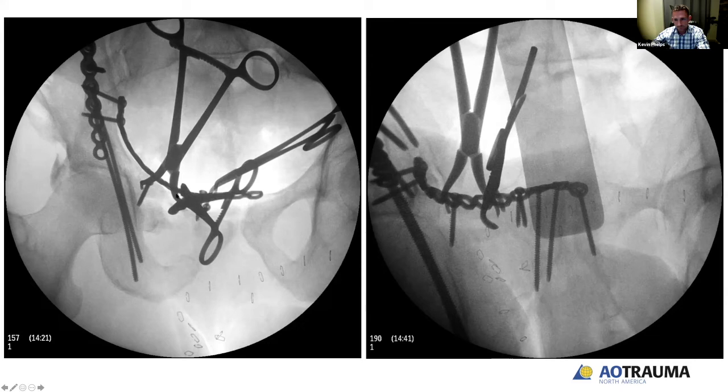So Kevin? Yeah. So up to this point, you reduced the anterior column to what would be the intact ilium. You reduce the posterior column, but now you're fixing across your ramus fracture with your sacrum still displaced. Correct. Yeah. Any thought about just stopping with your articular reduction and then moving on to the posterior pelvic ring? Yeah, for sure.